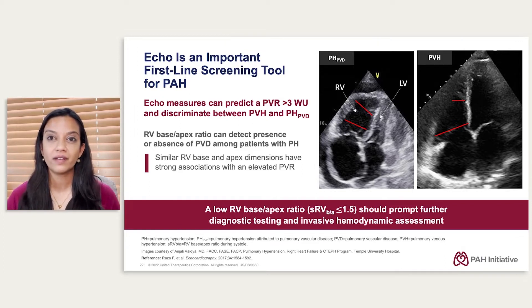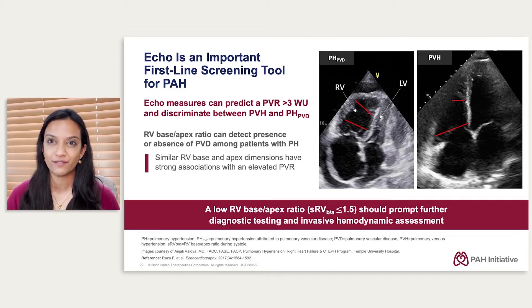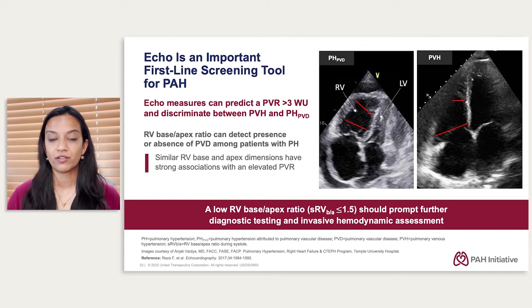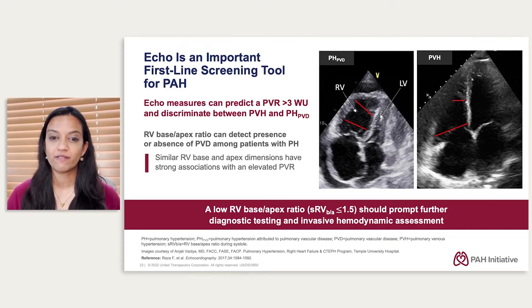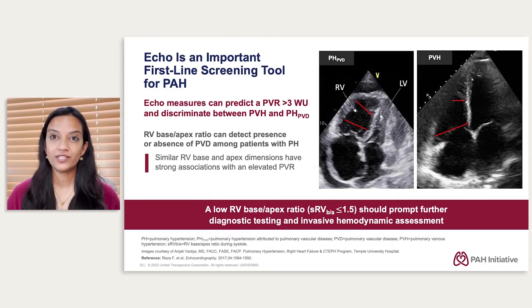This slide nicely shows one prominent clue. This is the apical four-chamber view of the echocardiogram. You can see the focus on the right side of the heart — the very large chamber on the left of your screen — which is PH due to pulmonary vascular disease, representing PAH. The right ventricle is bigger than the left ventricle. I want to bring your focus to the apex of the right ventricle itself: the right ventricle is forming the apex of the entire heart, and the angle of the right ventricular apex is wide open. That red line measuring the diameter near the apex is truly almost as wide as the dimension at the base of the right ventricle.